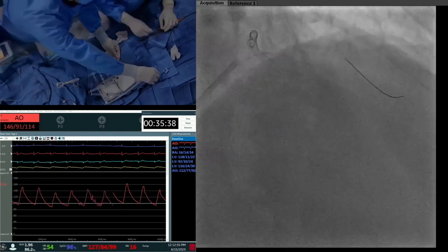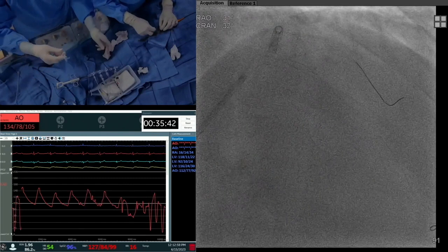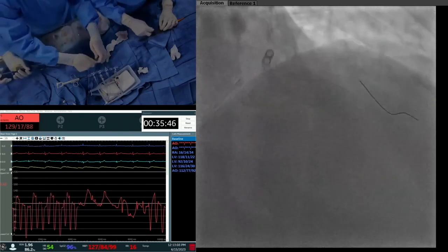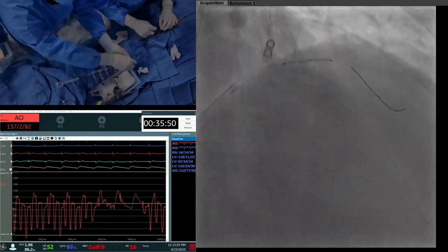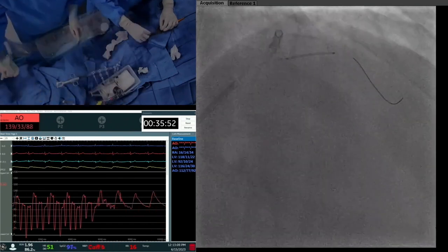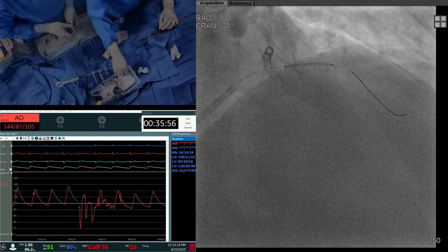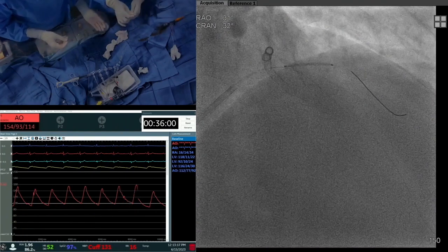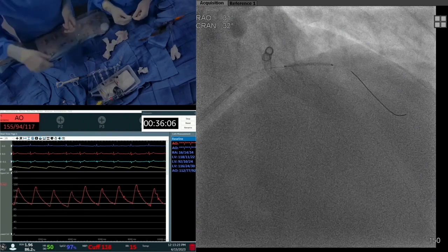So we are just going with the 2.5/16 stent to the diagonal. Let's go with the side branch stent first. You see there, you park a little bit distal, and now we will go. Now the length, actually, before even the IVUS was done, we had picked a length of 20 millimeter to the LAD. Now based on the imaging, tell us what is your length for the LAD.